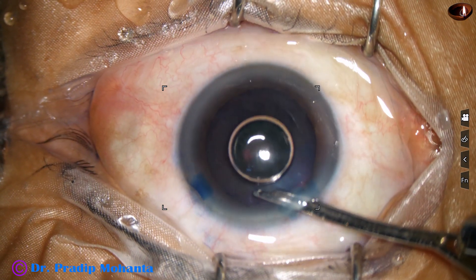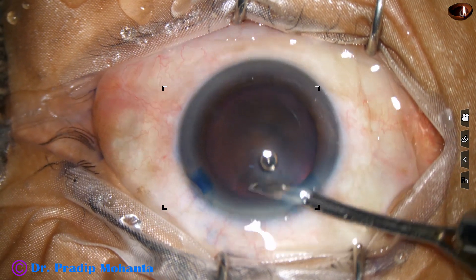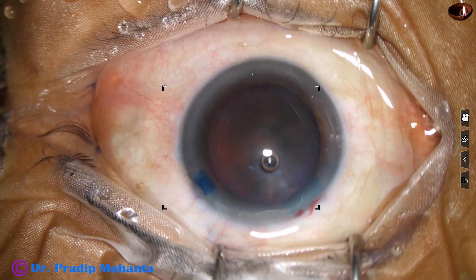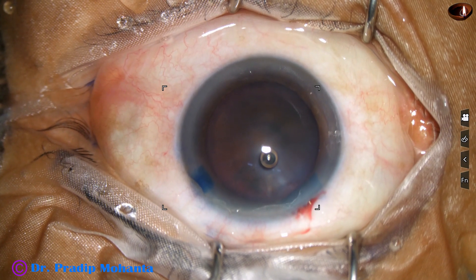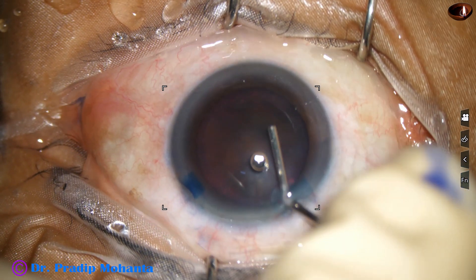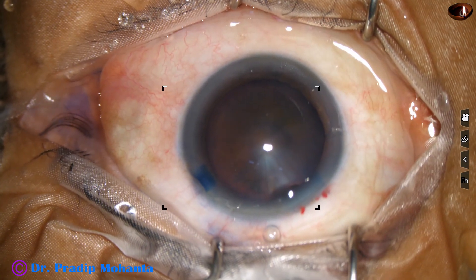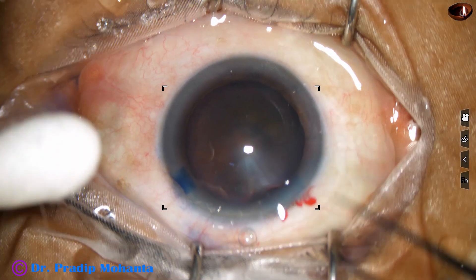The dye is washed out with BSS because if we wash out the dye, the density of dye in the anterior chamber is uniform. Otherwise, in some places the dye concentration will be more and in some places it will be less. That can cause some problem in visibility.